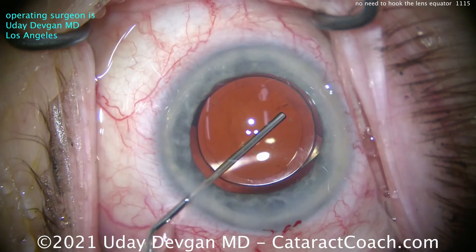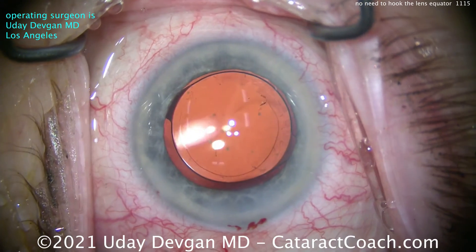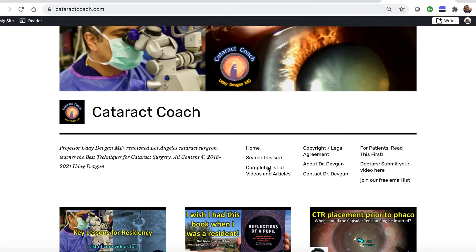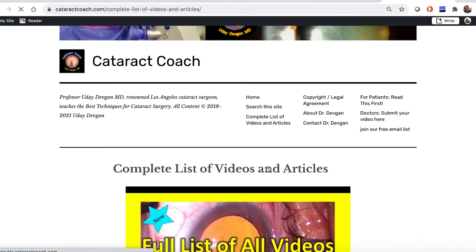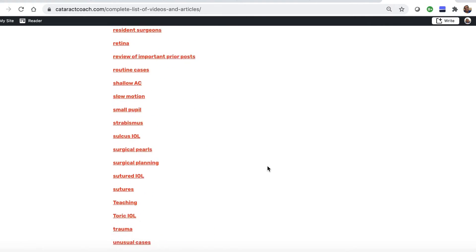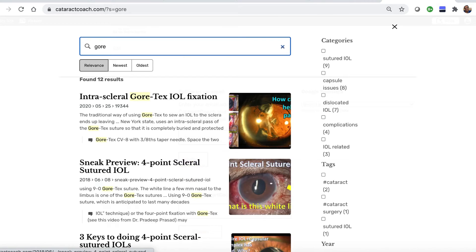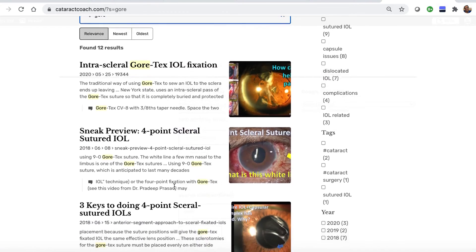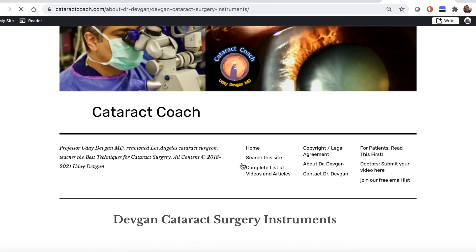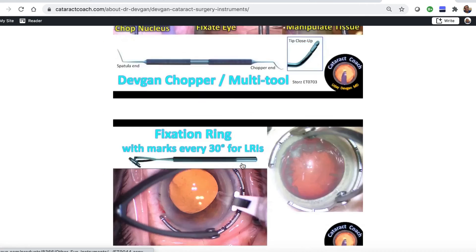Try this technique — I call it combo chop. We have many videos here on CataractCoach.com, and I think you'll learn to do this quite well. Check out the website at CataractCoach.com — it's a lot easier to navigate, with a complete list of articles and videos organized by category, and a very effective search engine. You can also look up About Me, where there's a link to my surgical instruments so you can find out for yourself — what's the name of those forceps?